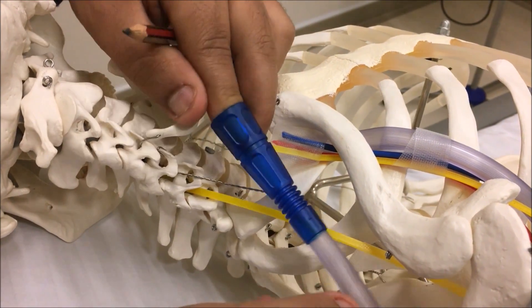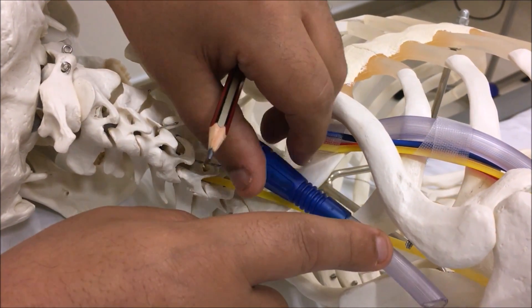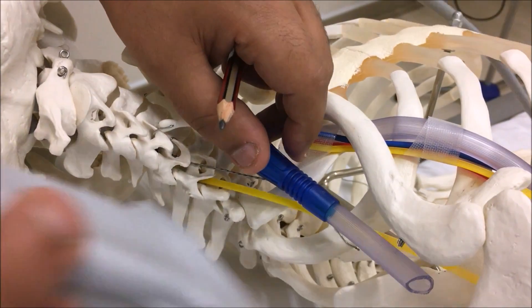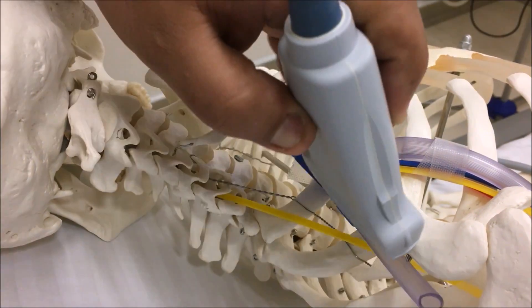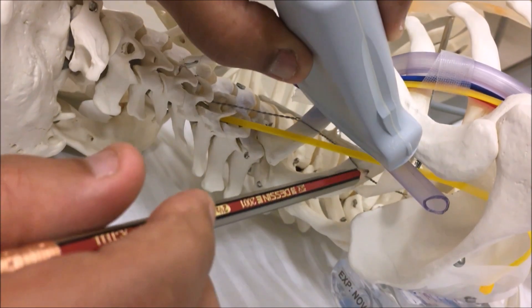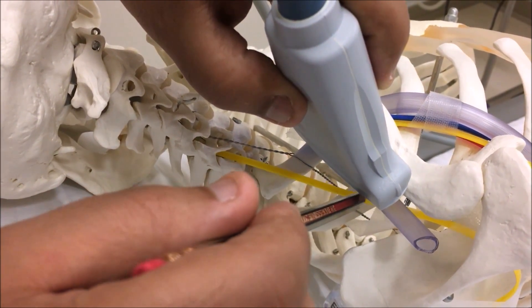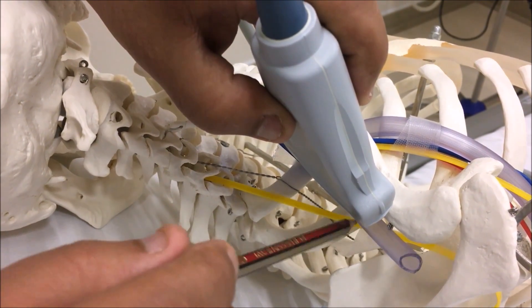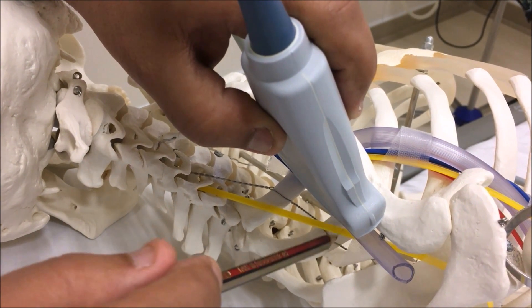For the sub-omohyoid suprascapular nerve block, we identify the omohyoid longitudinally and inject the local anesthetic deep to the omohyoid. We put the ultrasound parallel until we identify the omohyoid, then redirect the needle toward the deep surface of the omohyoid. We then inject our local anesthetic without needing direct identification of the suprascapular nerve.